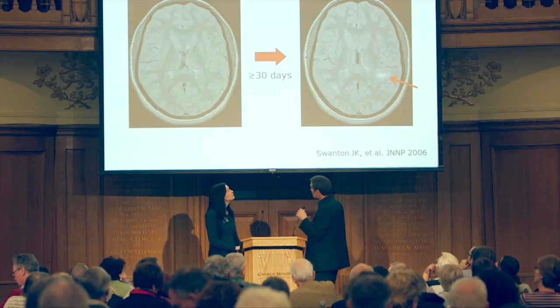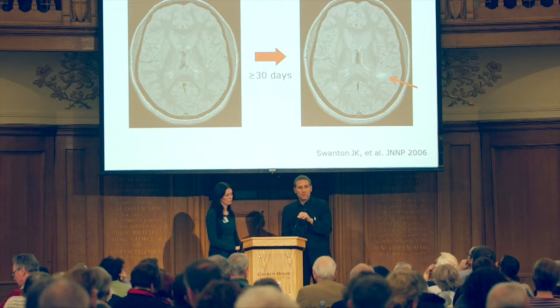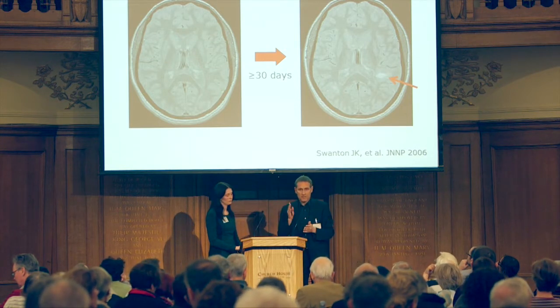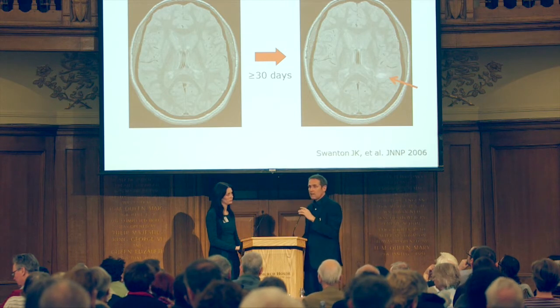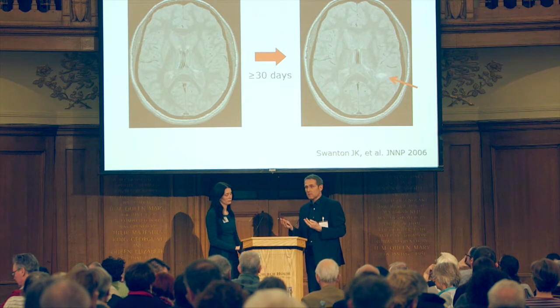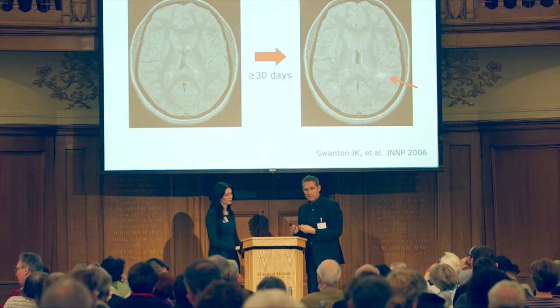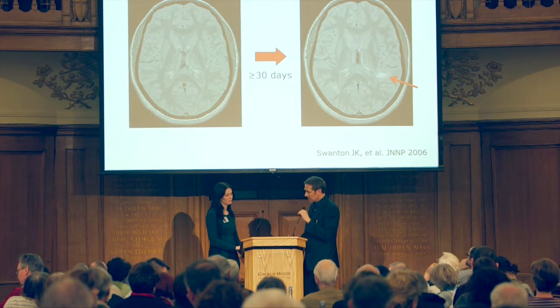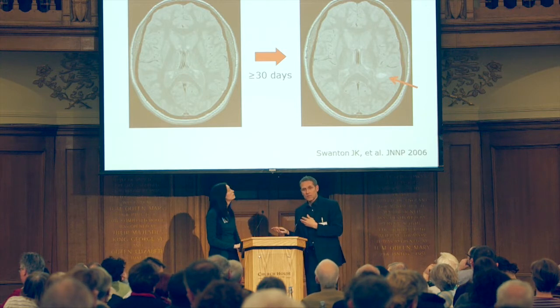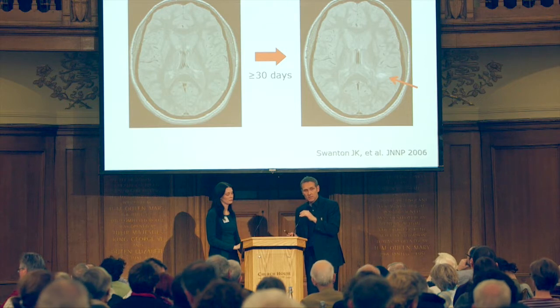Now, dissemination in time can be inferred from a scan that was done at the first, or baseline, time point already, when there is a mix of lesions that enhance after injection of the contrast medium, and many of you will have had that, and you have at the same time contrast-enhancing and non-enhancing lesions. Now that is the less common case.